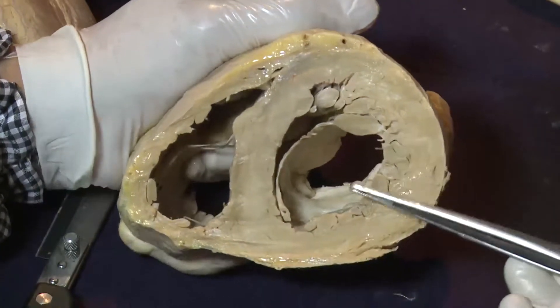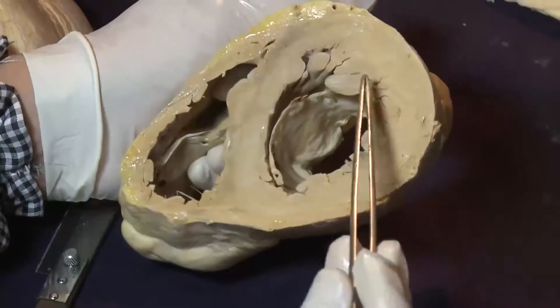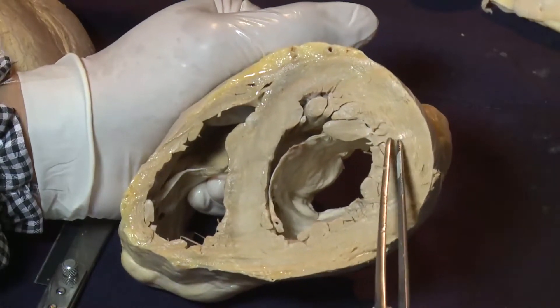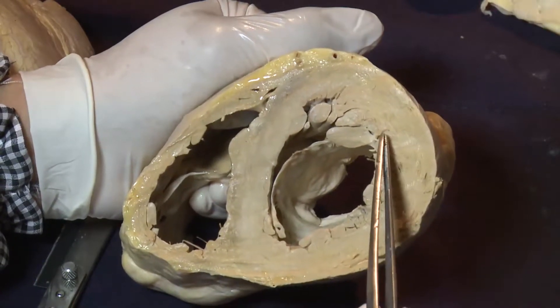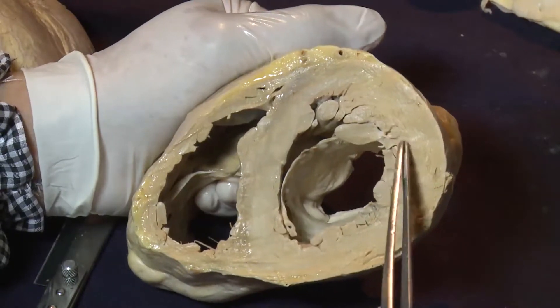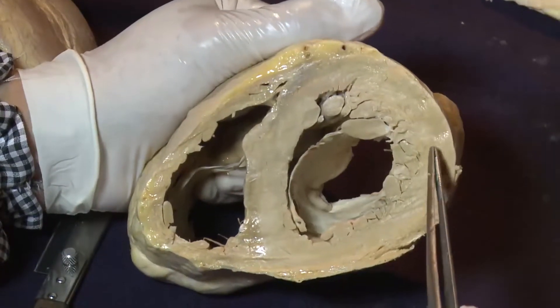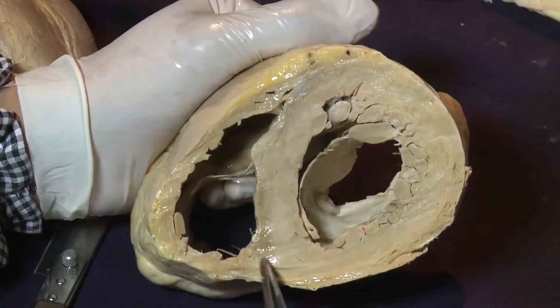But it's very clear there is no ischemic region here. There are still some focal fibrotic lesions, and we can examine whether that is a sequela of sarcoidosis or something like that, because sarcoidosis cardiomyopathy can leave some focal fibrotic lesions scattered throughout the myocardium.